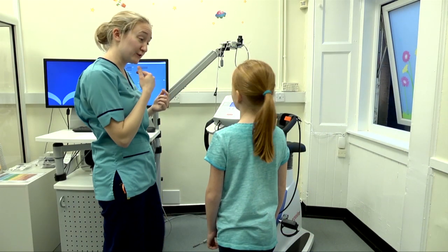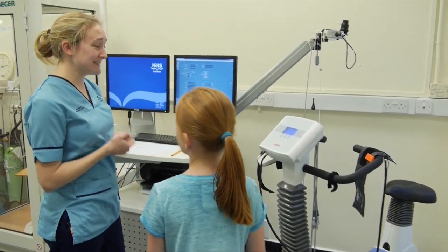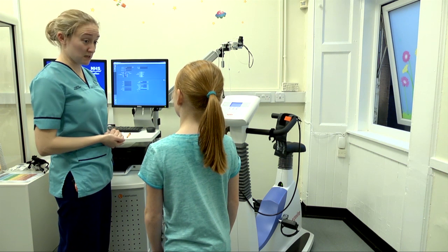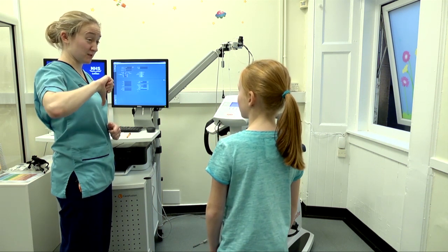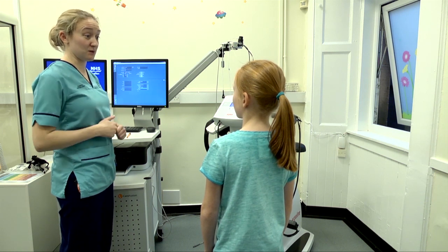You need to put a mask on over your nose and your mouth so we can measure all the air that goes in and out. Now, during the test, because you've got the mask on, you can't talk properly. So what we're going to do is use hand signals so you can tell me if you're okay. I'm going to ask you questions you can answer with a nod of the head or thumbs up for yes, or shake of the head or thumbs down for no.